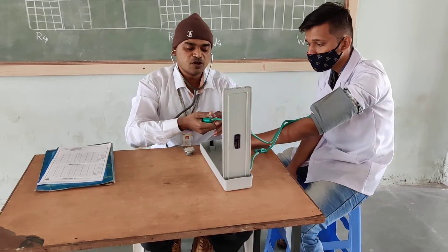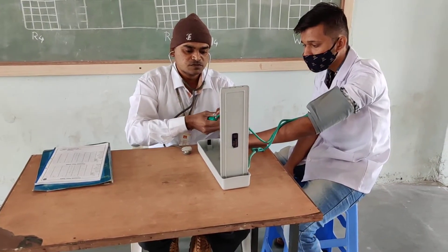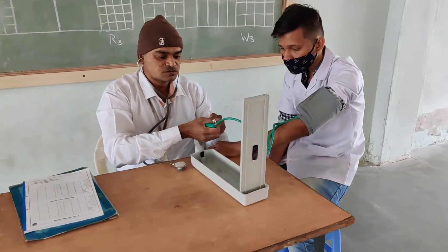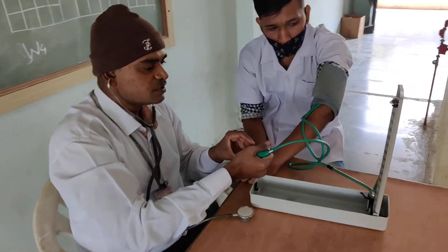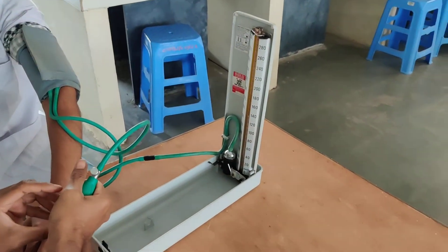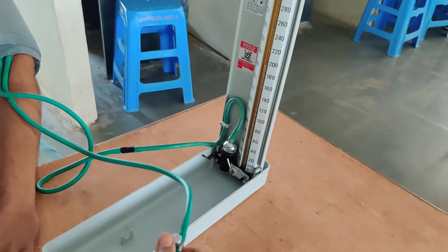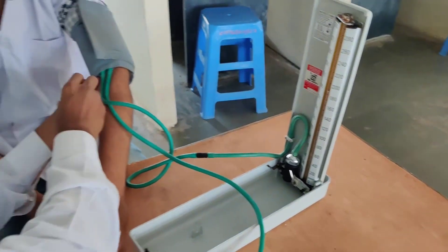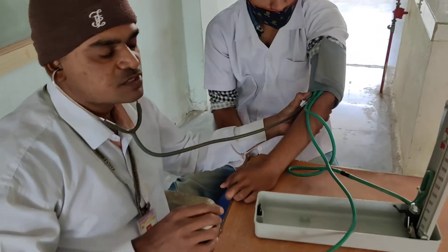Slowly, I have to maintain the pressure. When I am increasing the pressure, the mercury will increase. I will increase up to 180, and I will place this stethoscope here to hear the sound.